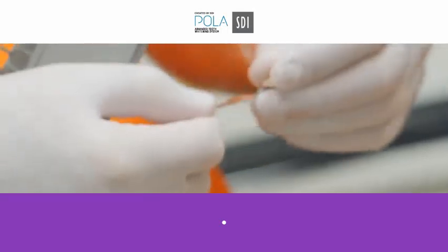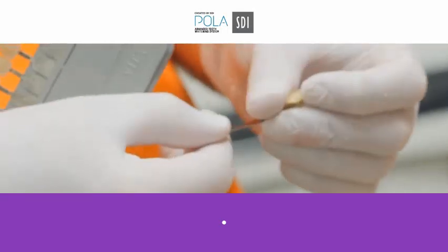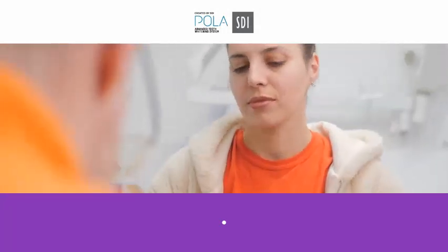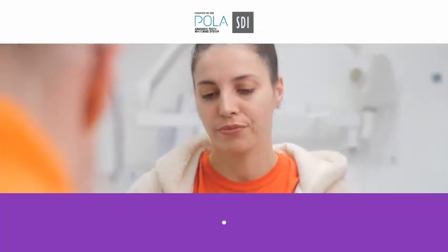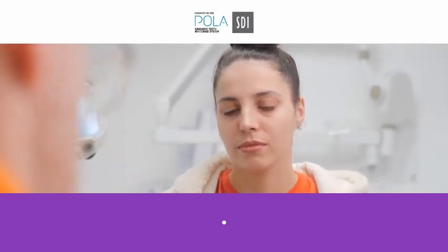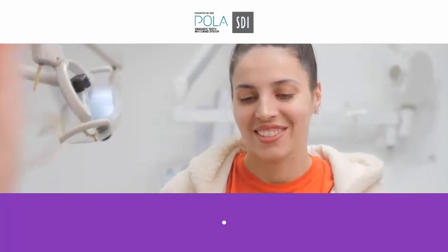So this is something that I really quite like with my patients. It's like a top-up treatment. It's like a pen, and you can paint it on the teeth. You dry your teeth and you paint it on. Keep your teeth dry for 30 seconds and then that's it. It's a really handy, nice little way to top up the whitening when you're going off and doing something. It's a really nice product as well.